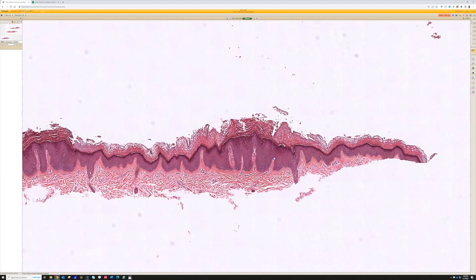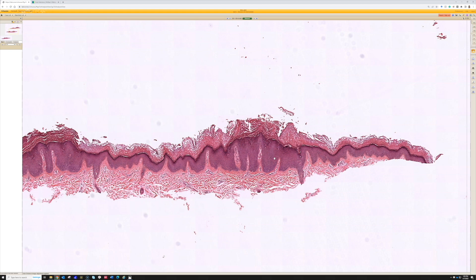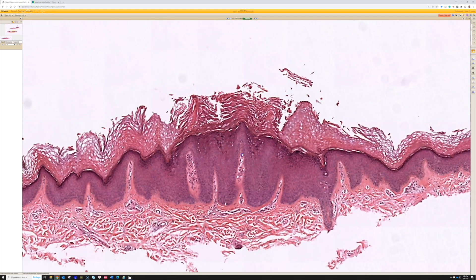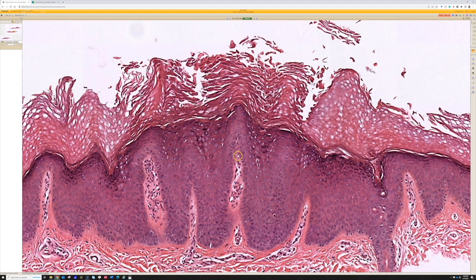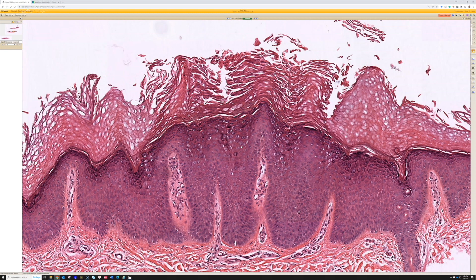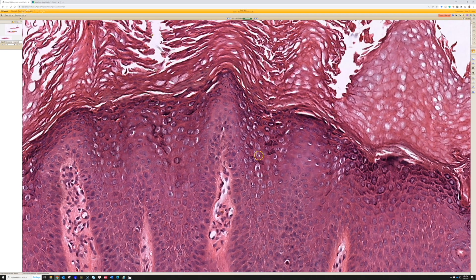What you see in verruca plana is a kind of subtle acanthosis — the epidermis is a little thicker than normal. To the side there is subtle, vague papillomatosis, but it's more of a gentle rolling or undulating hills rather than finger-like projections. In those areas of acanthosis and undulating subtle papillomatosis you will see very prominent enlarged vacuolated keratinocytes.